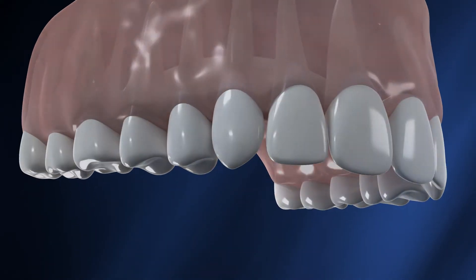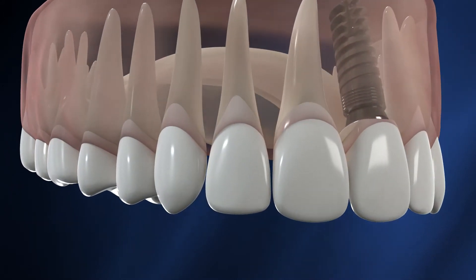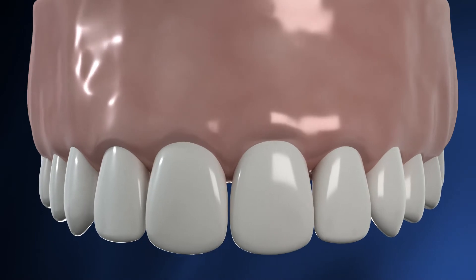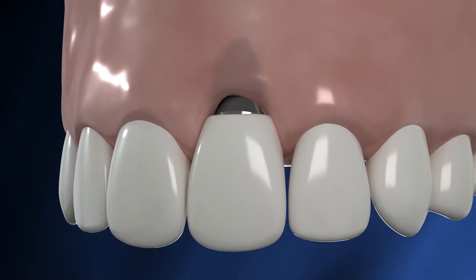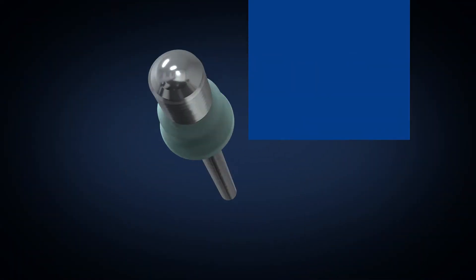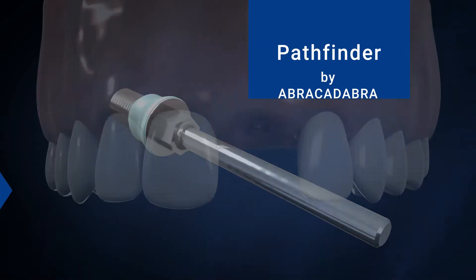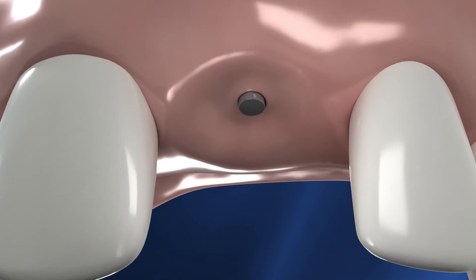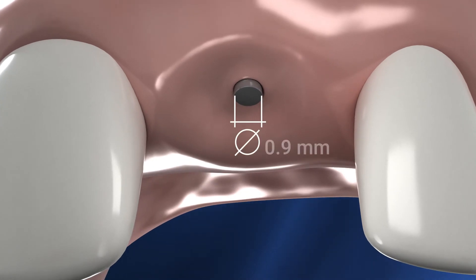In patients with a thin gingival biotype, uncovering the implants is a challenge, often causing loss of valuable peri-implant tissues. The revolutionary Pathfinder by Abracadabra enables lossless uncovering of the implants, providing easy and straightforward access without raising a flap.